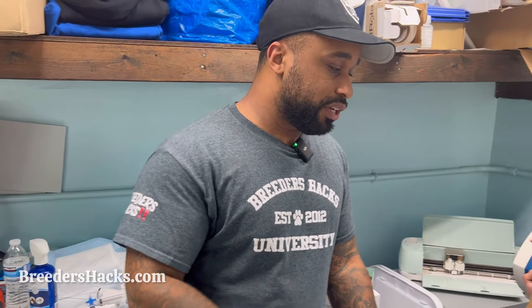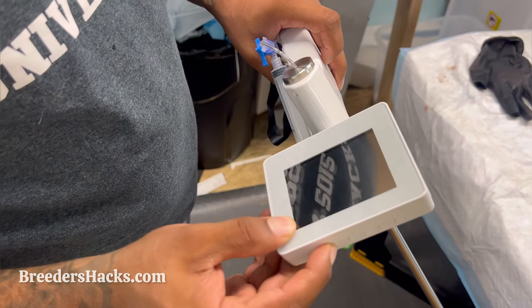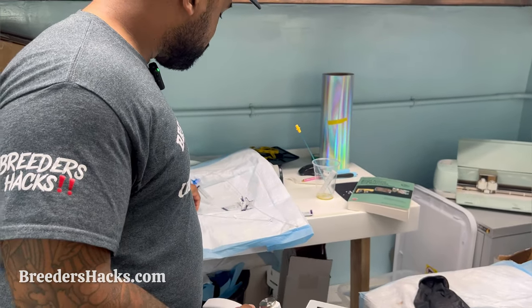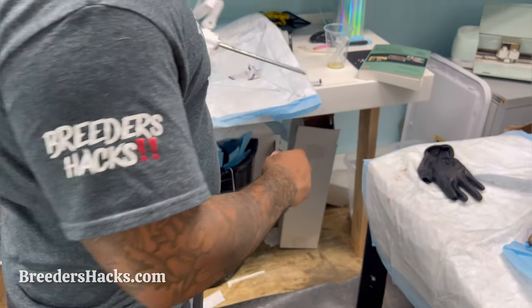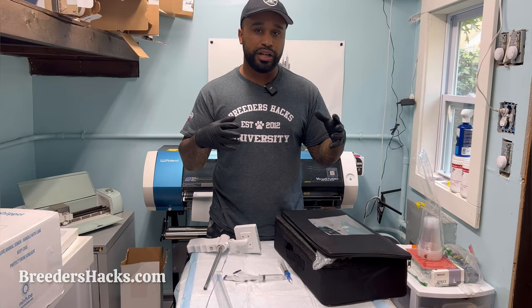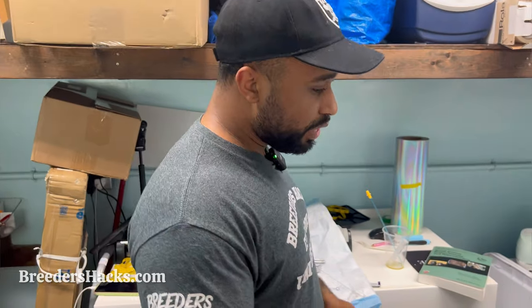He's just going to hold her for another five minutes and we should be good. Now I can take my TCI gun, turn it off, take out its contents, and discard everything other than the metal rod — I'll sanitize that with chlorhexidine. We have our SD card, so I can pull the footage and send it to the stud owner — keeping it as professional as possible. If you want more in-depth learning and visuals, I'll have a free instructional video that comes with our unit. Hope this information was helpful and useful — I'll see you guys on the next episode of Breeders Hacks.